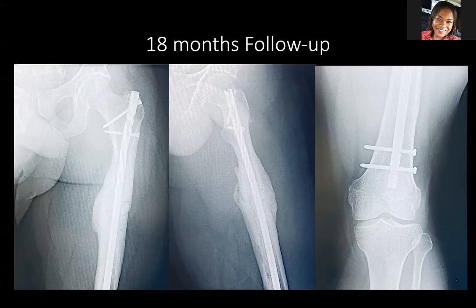According to the surgeon, the different implant was a longer plate, but it's still a plate. If one construct fails, most likely it will fail again for the same reason why it failed the first time. So if a plate fails, opt for something different. In most cases, it will be an IM nail, because probably the first decision was wrong. So surgeons, let's ask each other. Do not hide from the patient. You won't lose anything.